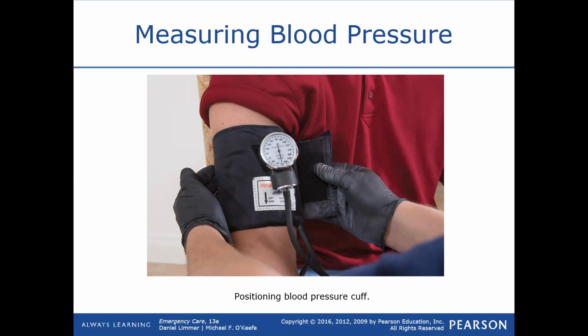See how it's pointing straight down? If you see that kind of oval, looks like a zero, but it's like a wide zero, okay? If that needle at no pressure is outside of that line, that oval there, that means that your blood pressure cuff is not calibrated properly. And there is a tool to fix that and adjust it. But you're not going to get an accurate blood pressure with that cuff.